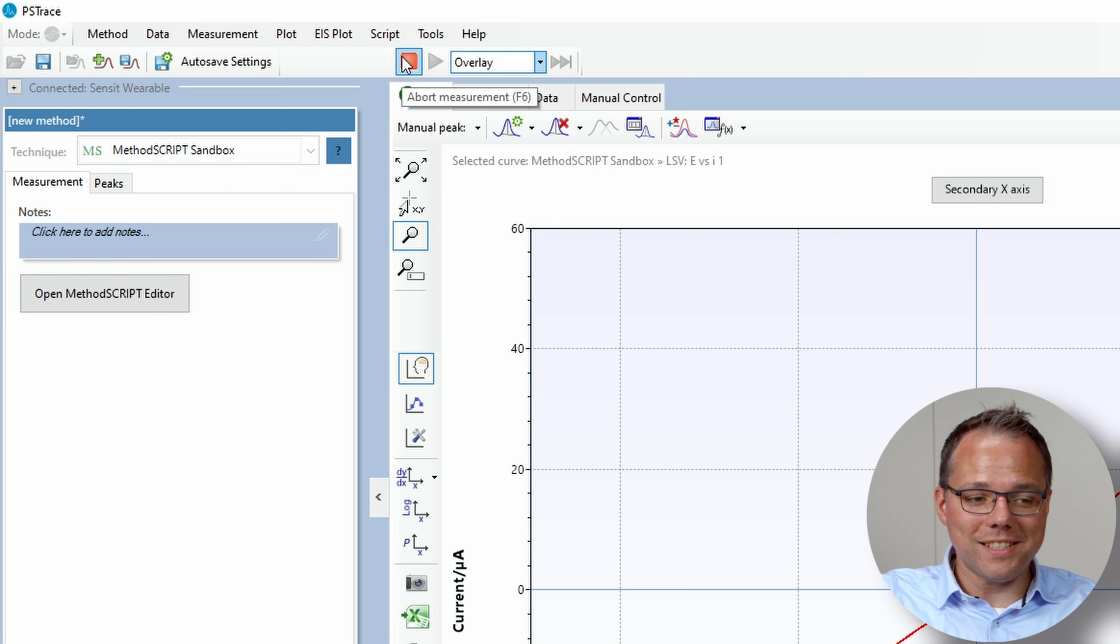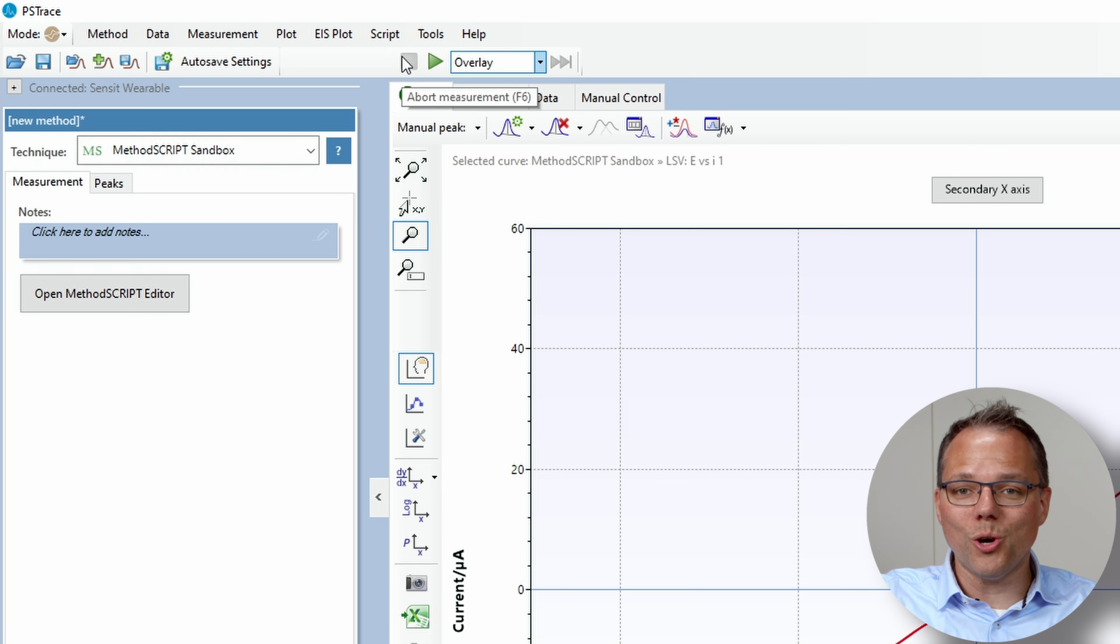If I now stop this method, because as I said it's hibernating, it's basically counting it as an ongoing measurement.